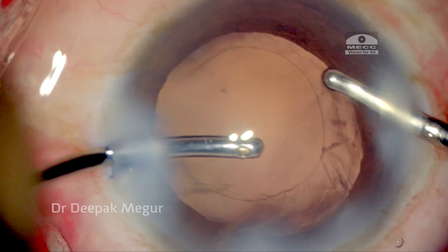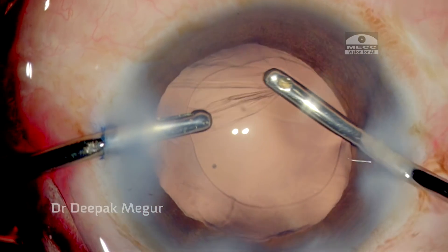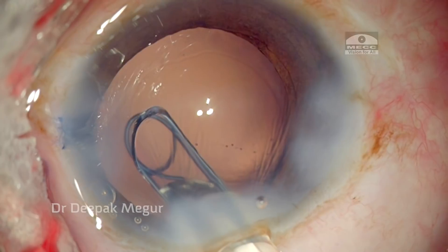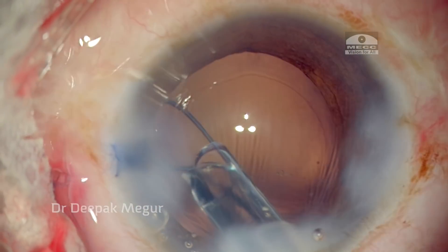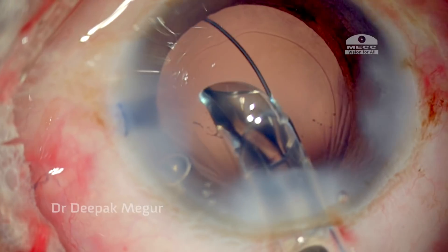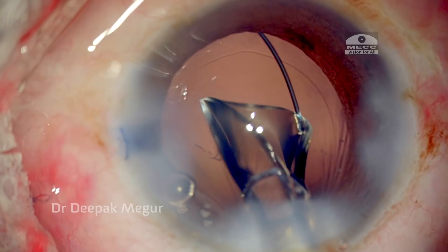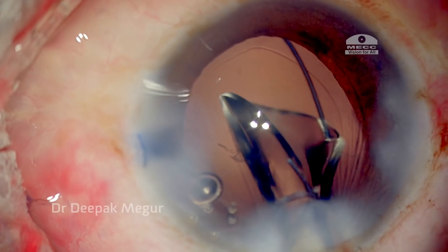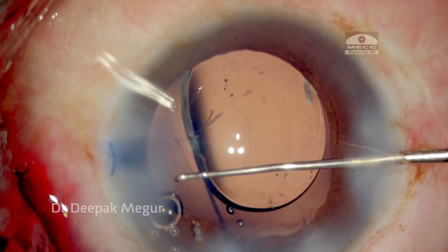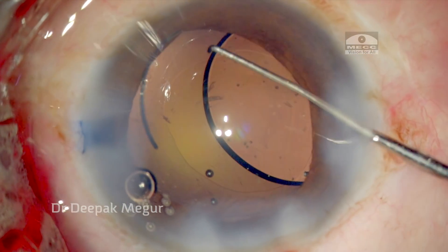The last bit of cortex is removed. For intraocular lens implantation I've chosen a multi-piece IOL. I create space in the ciliary sulcus using sodium hyaluronate. The proximal haptic is placed over the anterior capsule in the ciliary sulcus, and the lens is dialed so that both haptics are lying in front of the anterior capsule and in the ciliary sulcus.